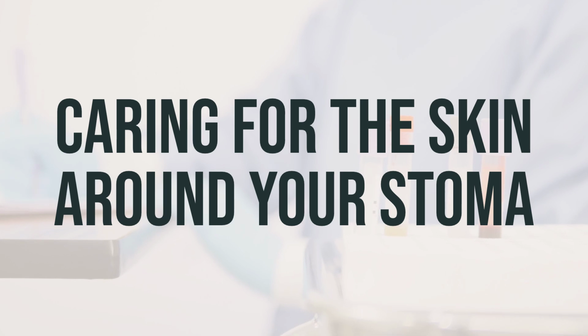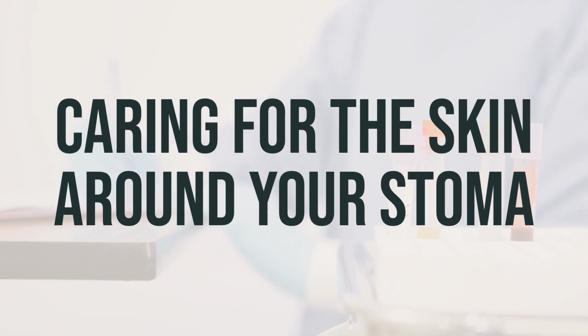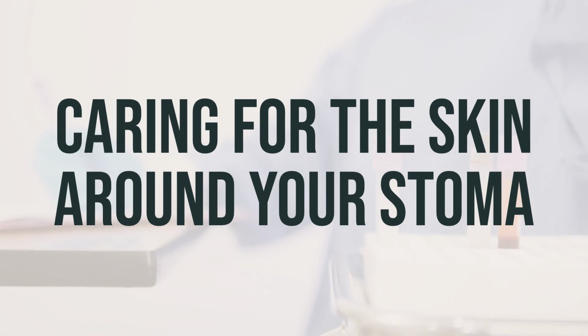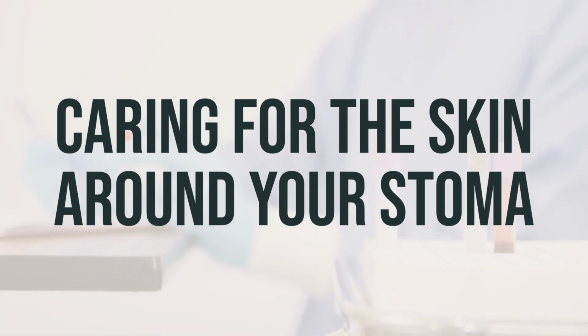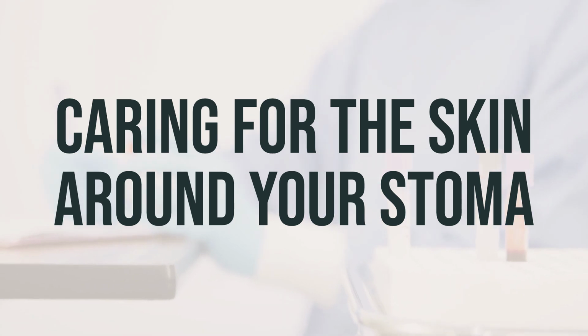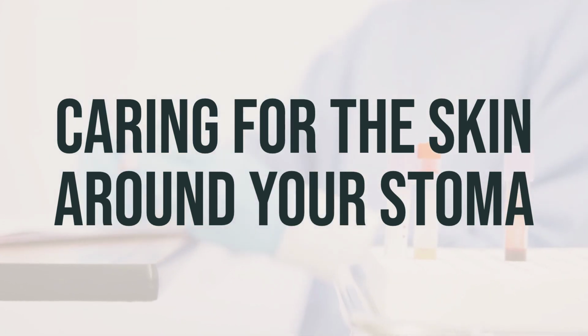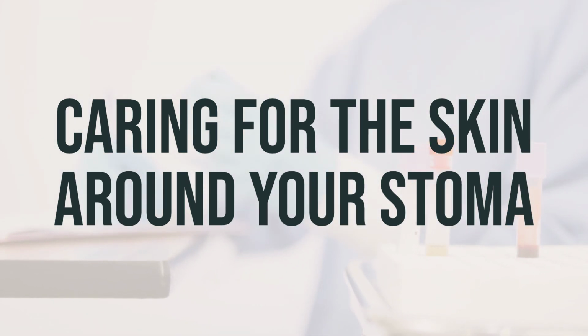When you empty your pouch, it's important to check your skin around the stoma for any signs of redness, irritation, or moisture. Catching any potential infection early is crucial, so be sure to reach out to your healthcare team as soon as you notice any issues. Sometimes, the products used in your pouch system, such as adhesives, the skin barrier, or the pouch itself, can cause irritation to your skin. Even if you've used them successfully for a long time, it's possible for them to start bothering your skin. In this case, your doctor can prescribe medication to help.